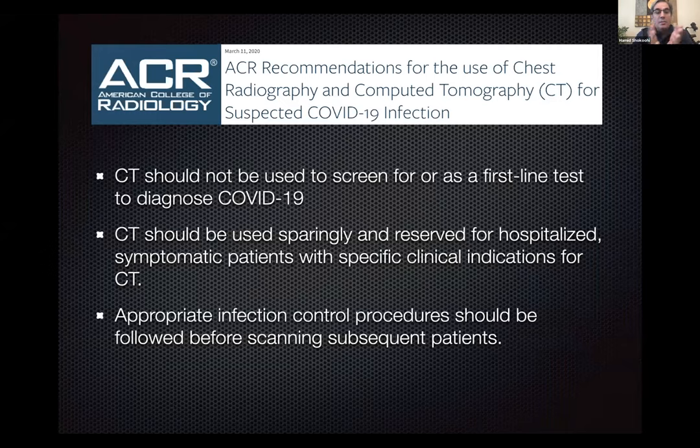The next question was, is this the one we want to do, like a CT scan for the chest or X-ray? Which one is the best to start? There is no best answer. The majority of these findings are used in different situations and different settings. If the only access you have is a portable X-ray, that is the best test. If all you have is the portable ultrasound, that is the best test.